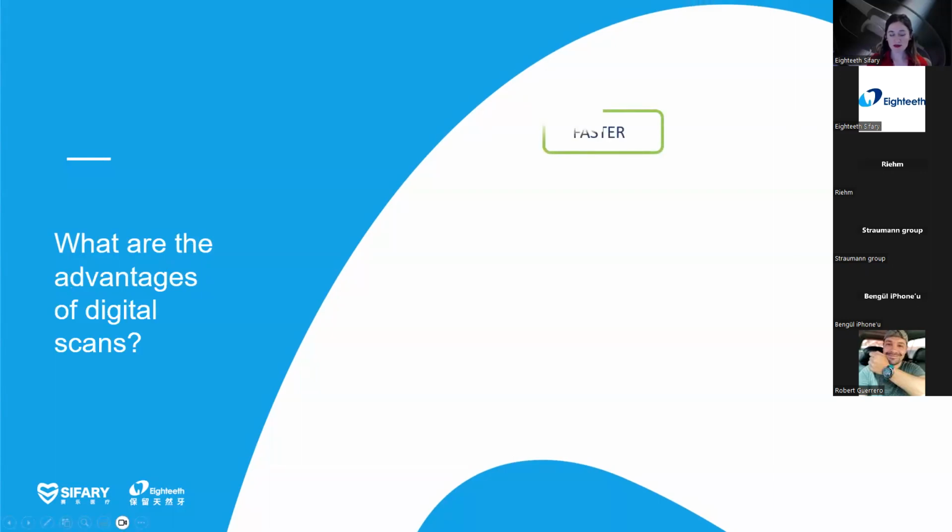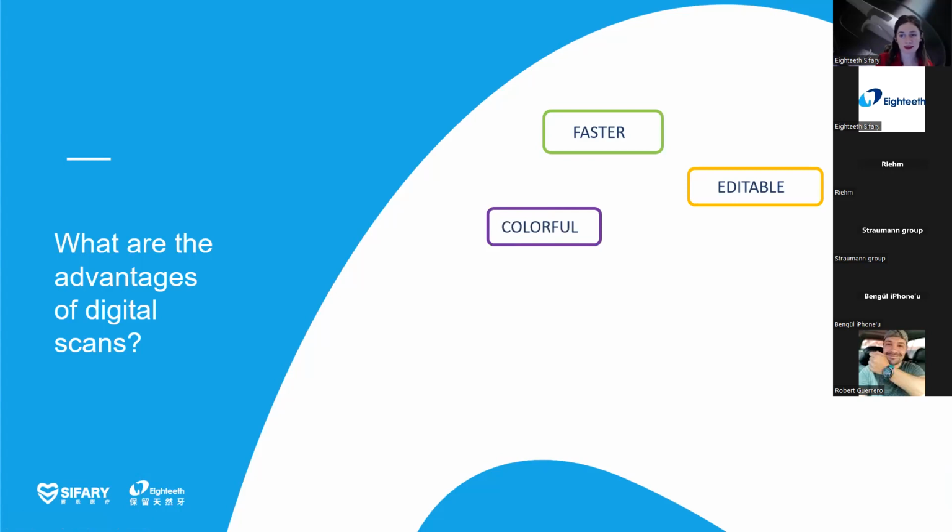What are the advantages? I can say first, it's definitely faster. It's editable, so you can rework your scan model again. It's very nice. You don't need to start from the beginning.